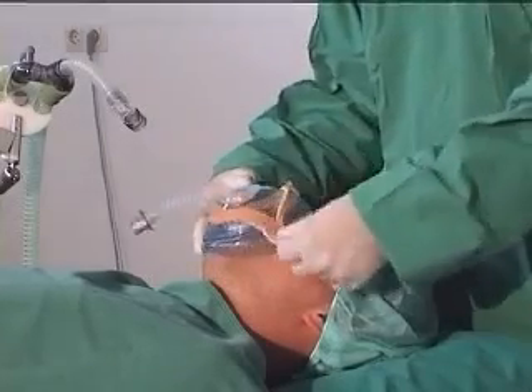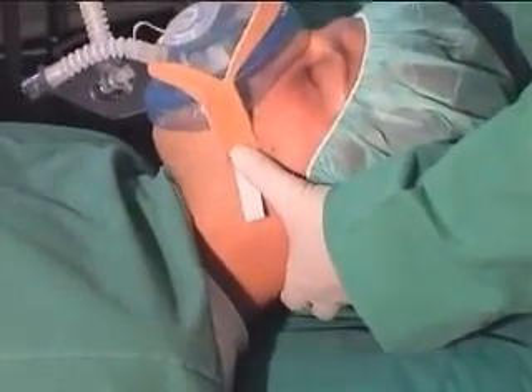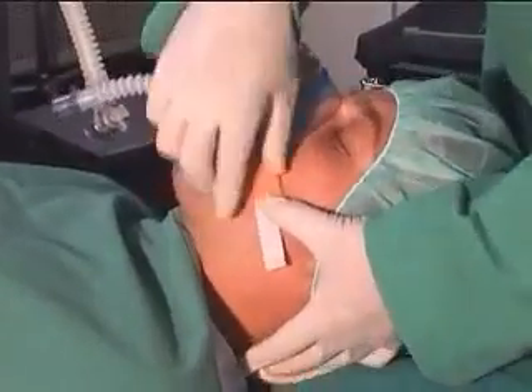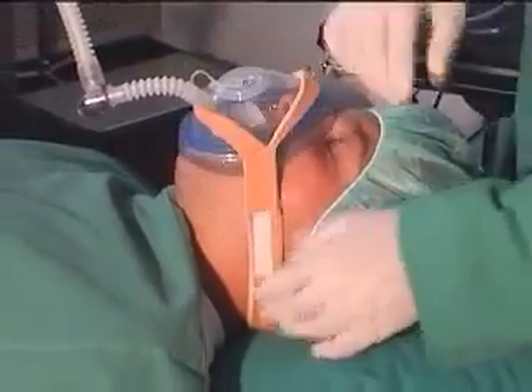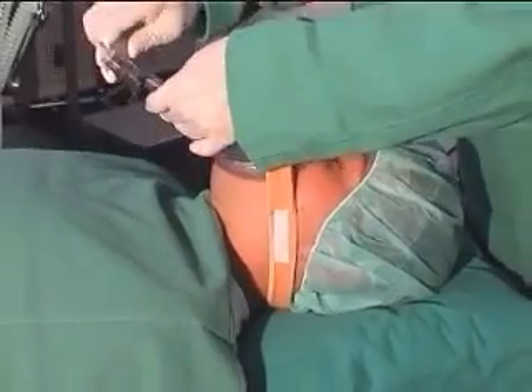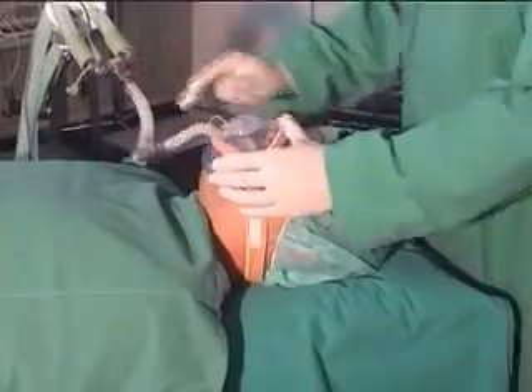Hand hold the mask to the patient's face or fix it with the fixation tape. Connect the breathing circuit to the mask for oxygenation of the patient during the whole procedure.